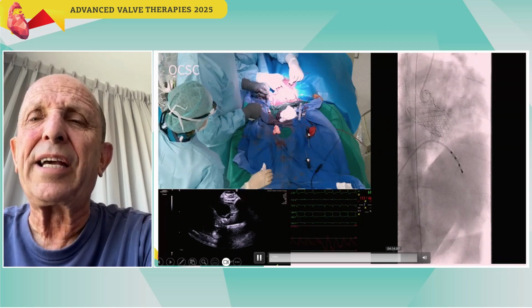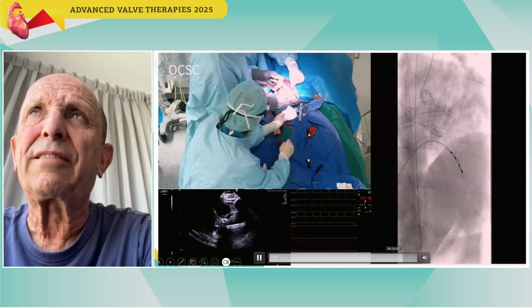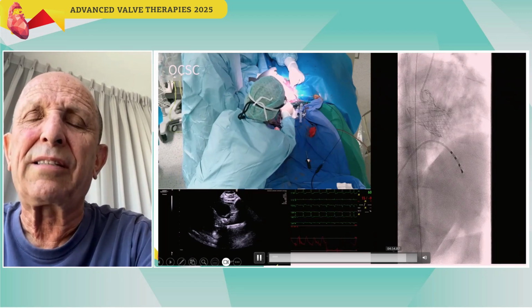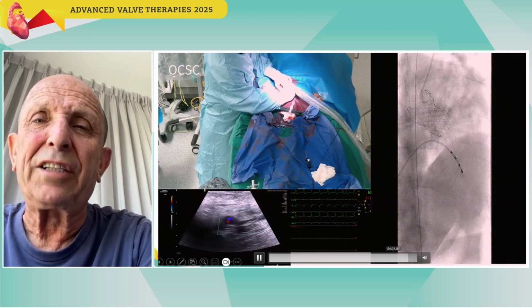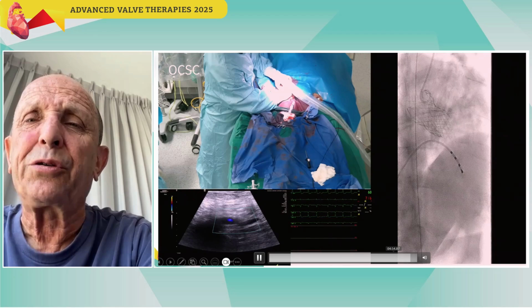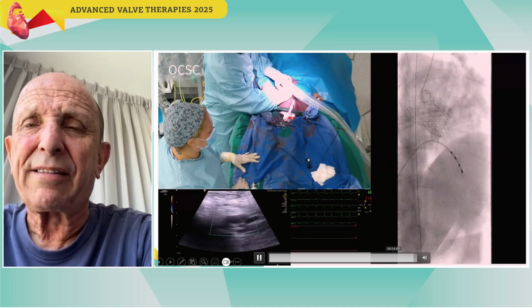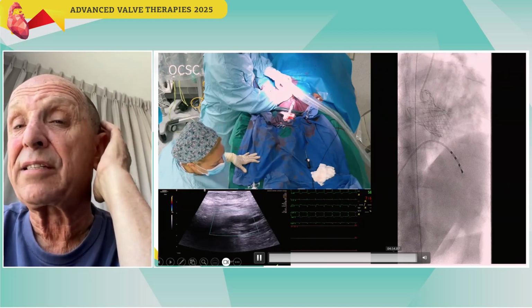I keep saying that you're doing pre-dilatation, then you're doing a post-dilatation. So what's the difference from a balloon expandable valve? You did not compromise on less than a perfect result, and in order to have it, you did a post-dilatation with the same balloon that would have been used in the balloon expandable valve. So I don't think that one device is better for this case, but balloon expandable is definitely as good as self-expandable in this case.